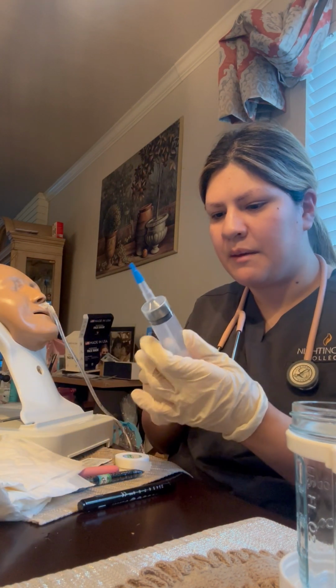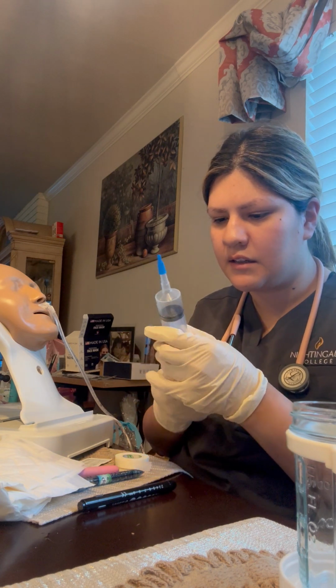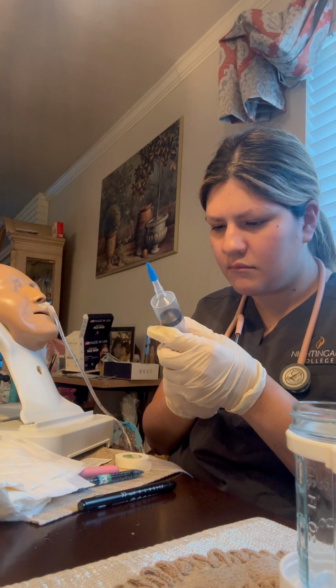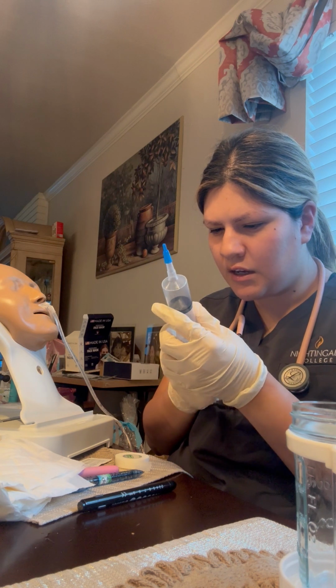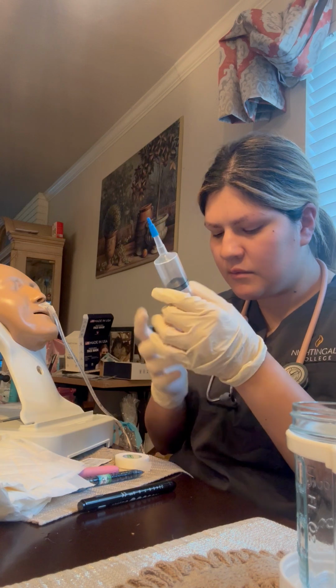So at this point, I would get my 60 milliliter syringe.